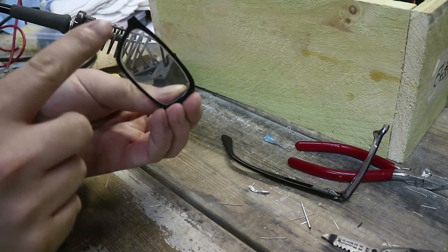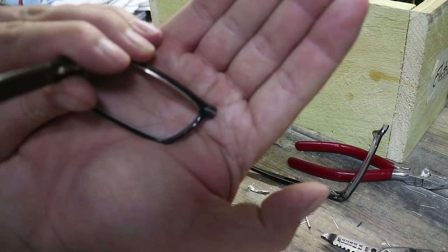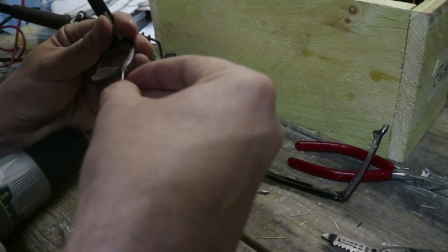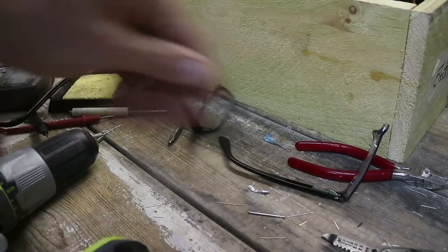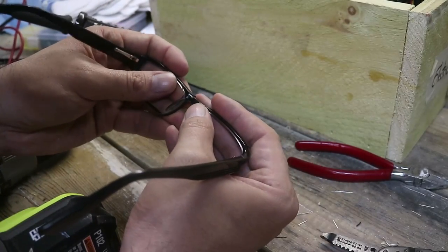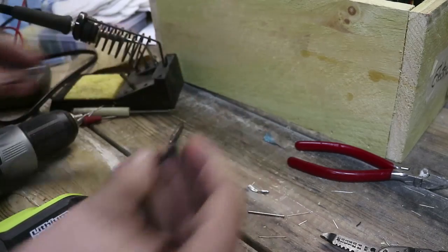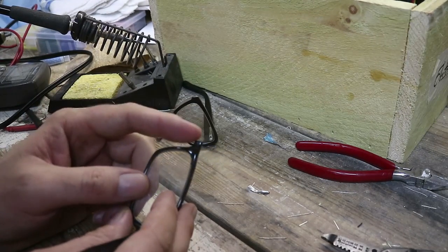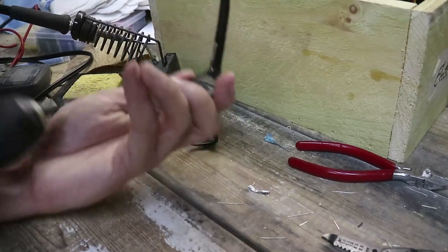And since these are black on the front, you're not going to ever see that. Let's see if I can. You can see the little thing there. And my finish nail, or my brad. Not a super tight fit. Maybe I'll cut off a nail or something. So now what I need to do is try my best to get the hole to line up vertically. So I'm just gonna have to eyeball it and hope for the best. Scribed a little line there to kind of give me a better shot at it. Ends up that's at the top, so I'm gonna put the drill bit just below that. And we'll see what happens.